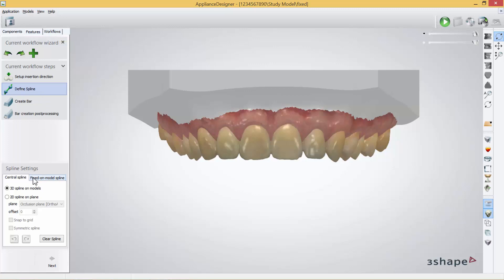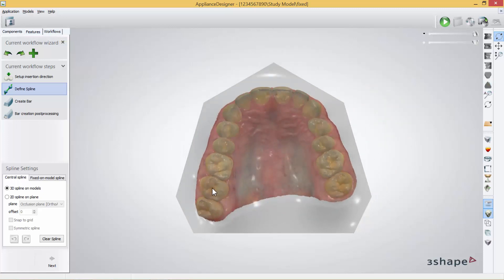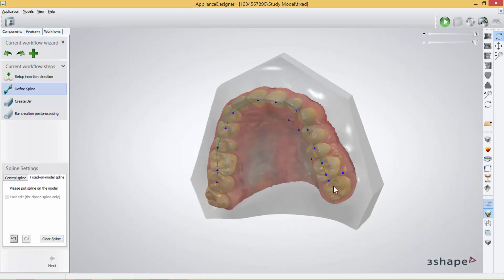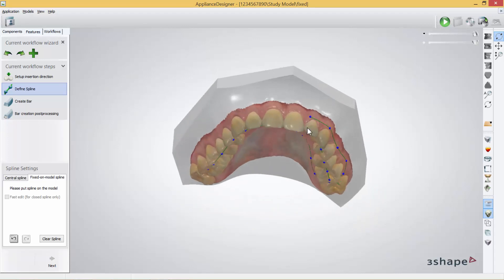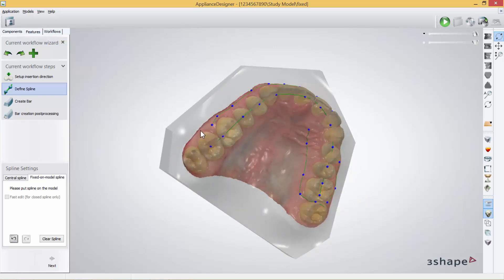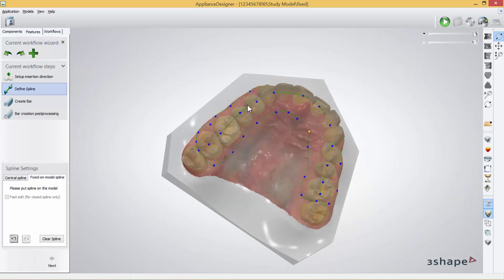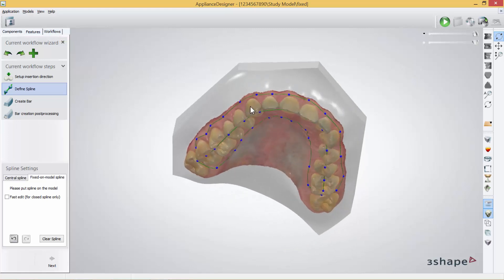To create a bar using Fixed on Model Spline, first you need to create a central spline line. I will turn over my model and create my central spline line like this. I will now press Fixed on Model Spline and then I will have to do a spline wrapping around the central spline. Now I have created two spline lines — one wrapping around and one central one. I will press Next.